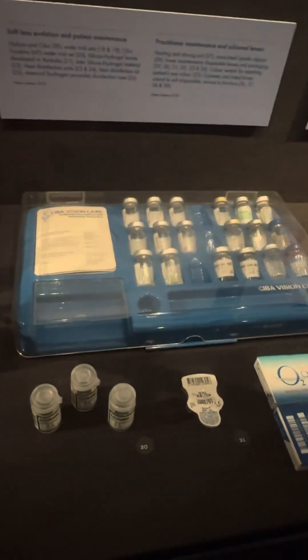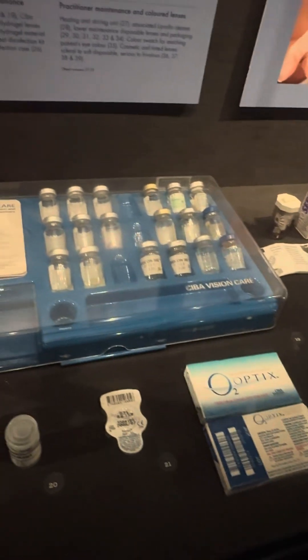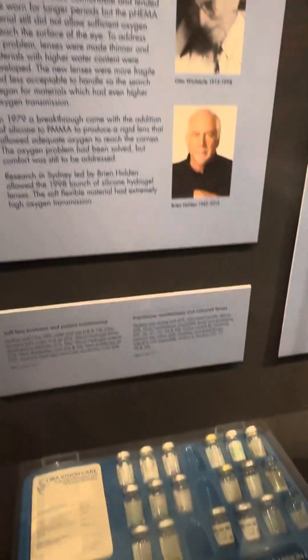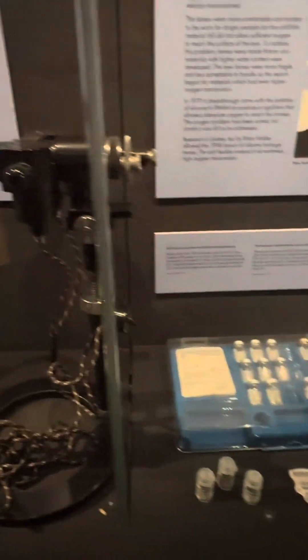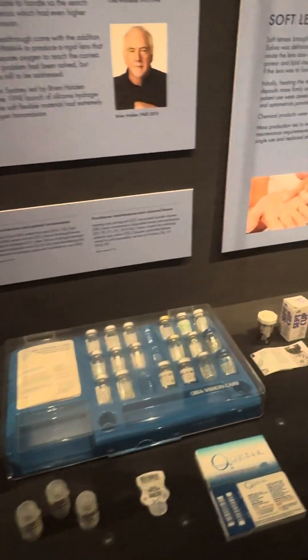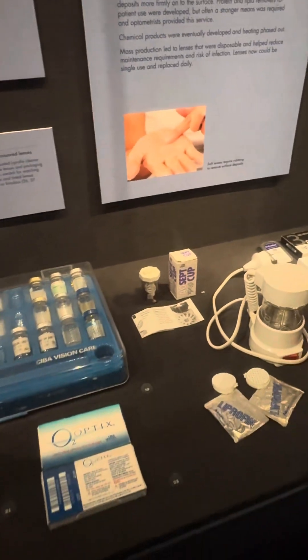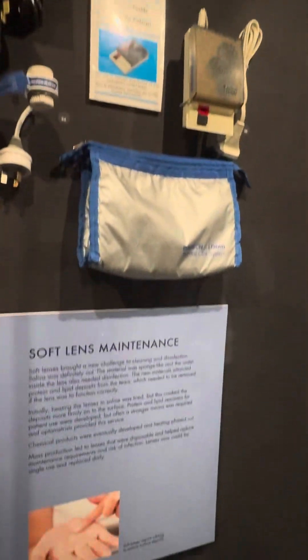Soft contact lenses came out in the 1960s. In the early stages you'd still measure the shape of the eye and find a lens to fit. With the old hard lenses, the optometrist was often making them on-site at the practice. With soft lenses, they started being manufactured by large companies.